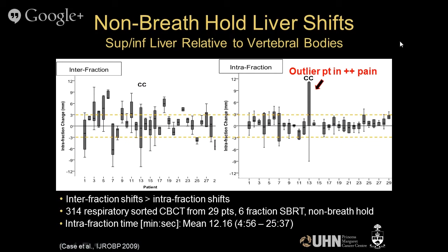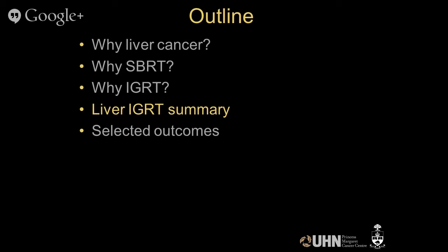And this patient, in fact, had capsular metastases causing pain. And interestingly, after his first 2 treatments, when pain responded, he had improved reproducibility and less intra-fraction variability for the remaining treatment. So what are some approaches that we can use to image guide and treat these tumors appropriately?